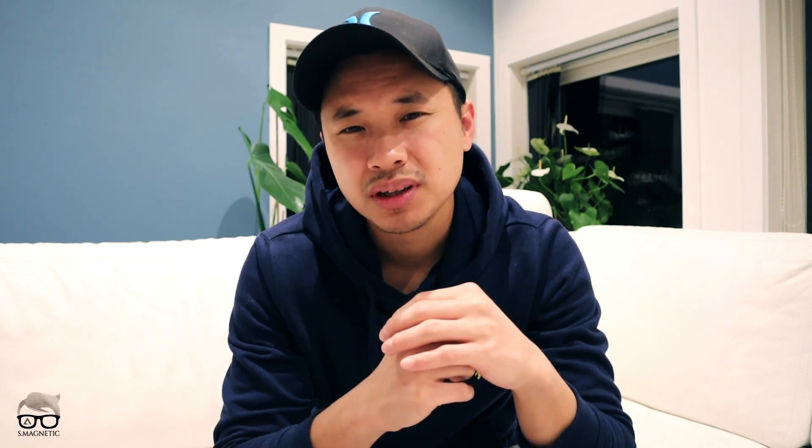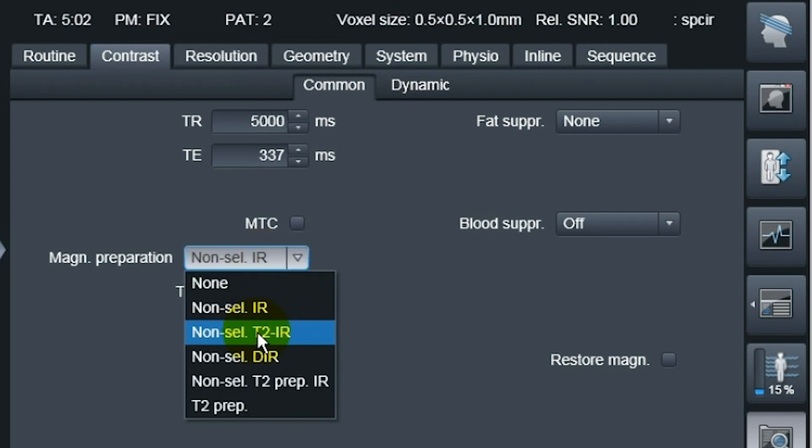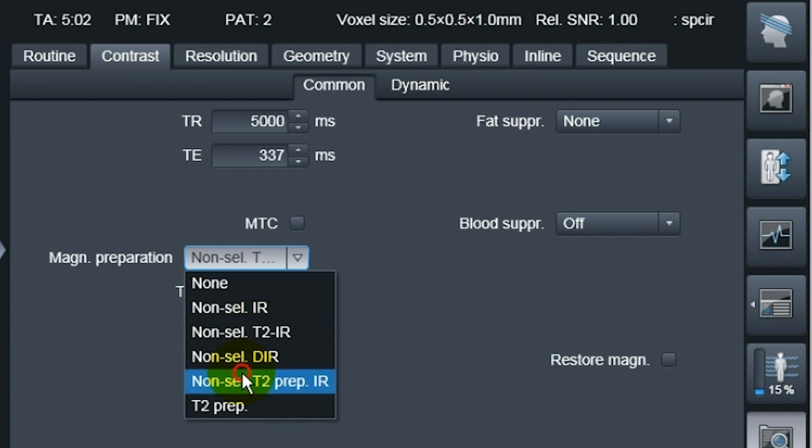If you look into your protocol and then you go to the contrast card, usually we are using the non-selective T2 inversion recovery pulse, but now it automatically has changed to non-T2 prep inversion recovery. So this new pulse, this is what happens in your protocol. It automatically changes.